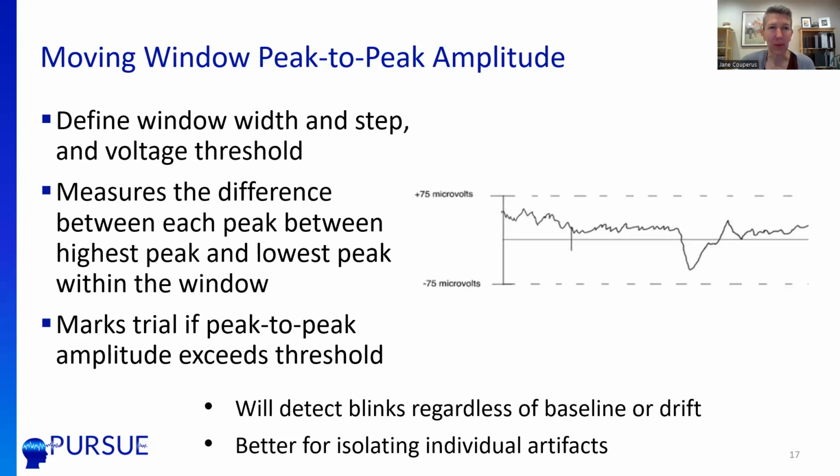A second method is something we call the moving window peak to peak. This is defining a window width and step and a voltage threshold. And it basically measures the difference between the highest peak and the lowest peak within a window. And then that window moves over time. So you have a window and it's moving along your trial, and it's saying, okay, is there anything within that range within that window? And so in this case, it's going to catch a blink right there, and then it's going to move on. So it's going to detect blinks regardless of baseline or drift, and it's better for isolating individual artifacts. So in this case, there was a window set for 200 milliseconds with a 75 microvolt threshold, and it's going to catch those blinks that fall within that moving window. So this is a secondary great option for catching those blinks.